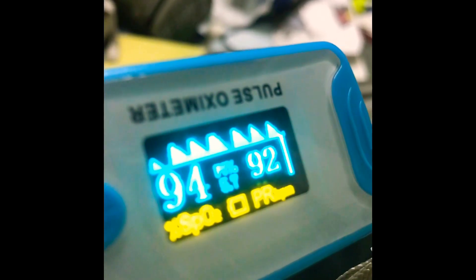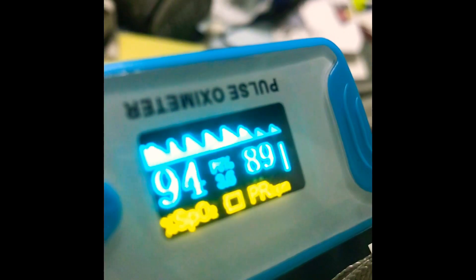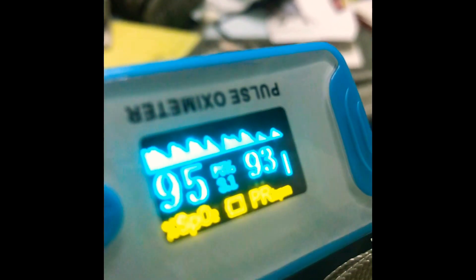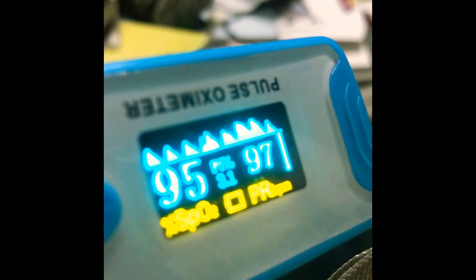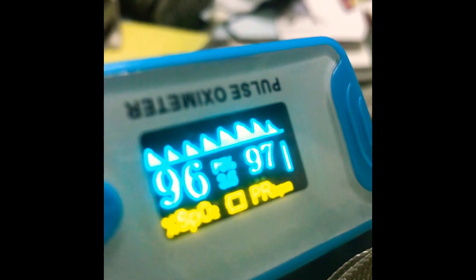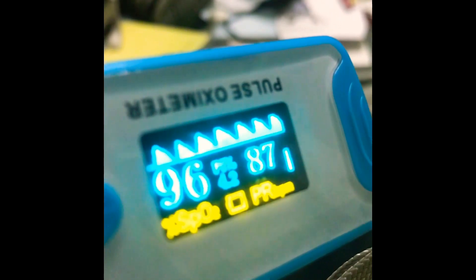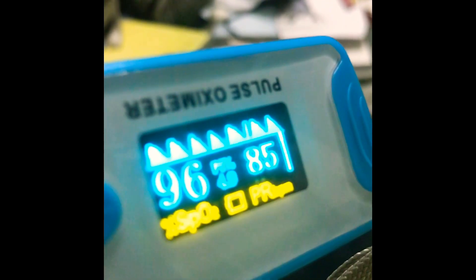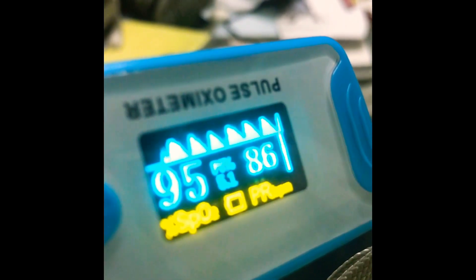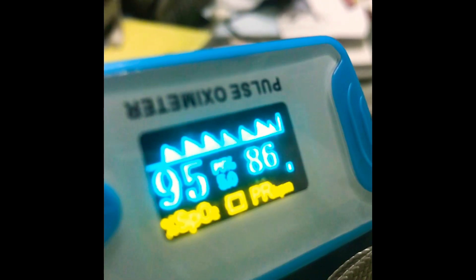I am just going to remove my mask and check how my saturation changes. I have removed my mask. I am just doing normal breathing, just like the usual single breaths. It is coming back to normal — 97. And my heart rate is also slowing down.